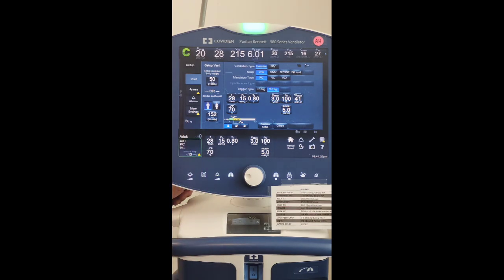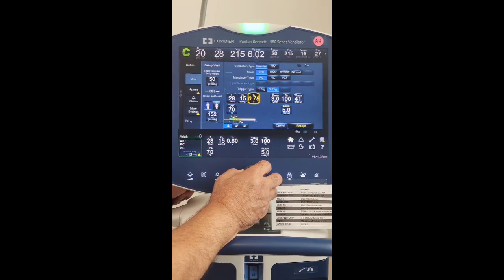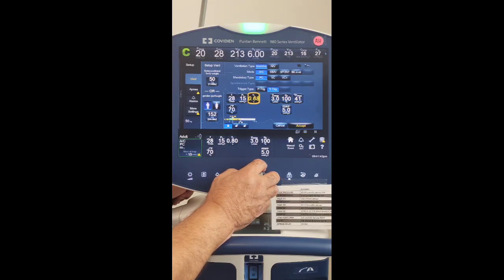We can try, and the way to do that, again, we're going to make I time shorter. We're going to shrink it instead of 0.8 seconds. Let's see how far we can go down to bring our IE ratio. So I time, we're going to change that, and let's see. As we're going down, our IE ratio is changing, 1 to 2 now, maybe 0.5 seconds.